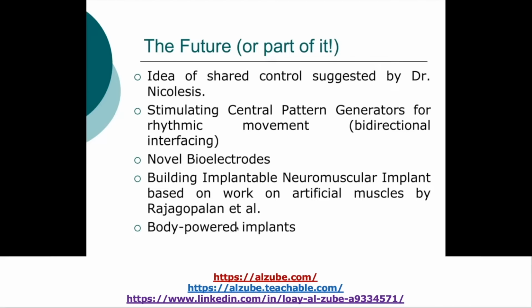And then that led us to something called body-powered implants. So the challenge of having reliable power supplies. So we're trying to use the body to power the implants, especially vibrations to charge batteries inside the body. And there are a lot of ways to do this, but I'm not going to go into it, but this is part of the future that we're hoping that we can develop.